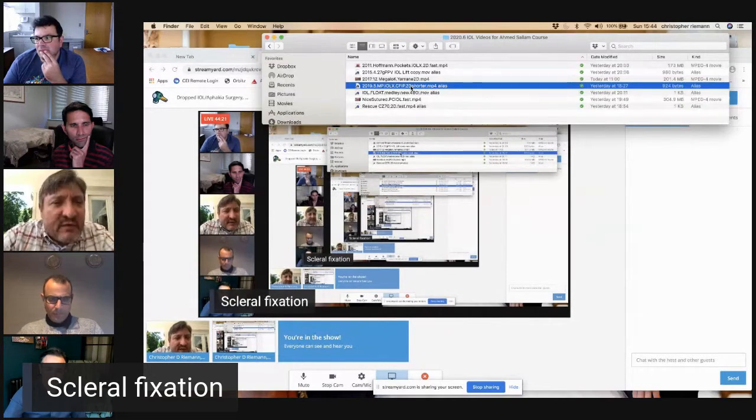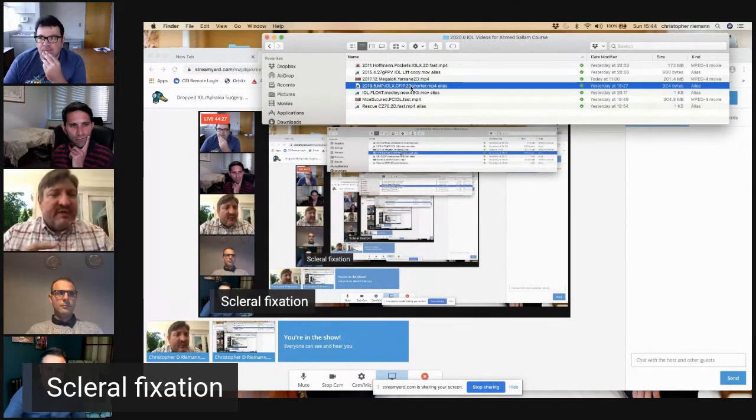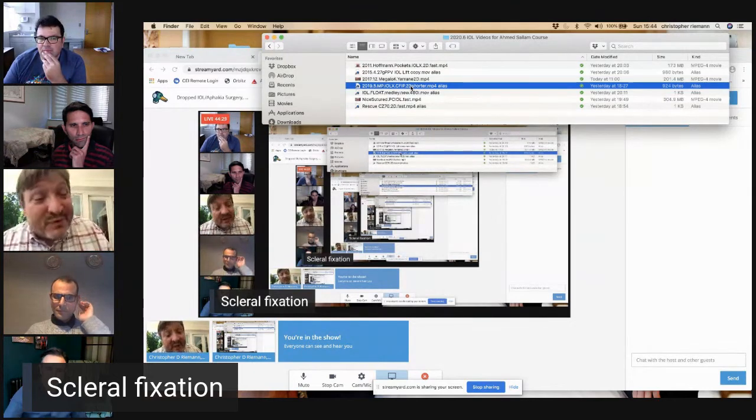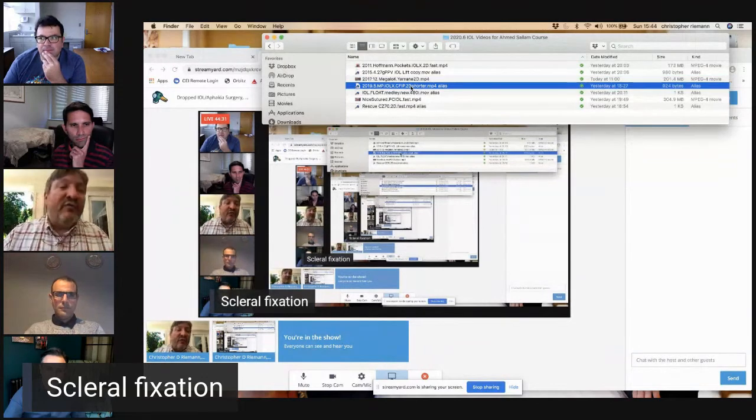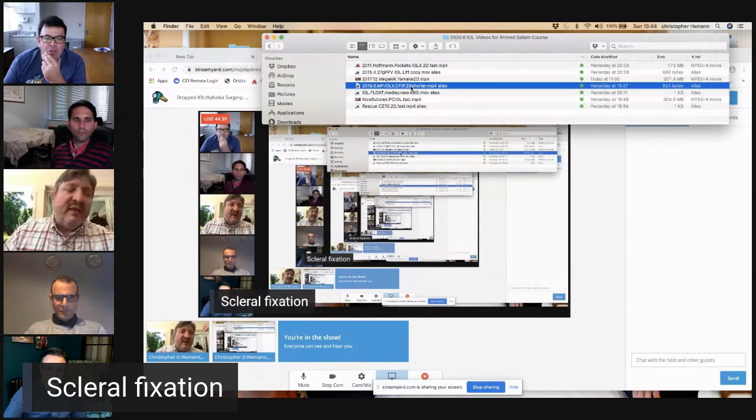In this particular case, honestly, I'm much faster if I open the conj and then close it, because of exactly what you're saying. But in this case, I really wanted to preserve the conjunctiva for some glaucoma procedure down the road, which we were able to do. But there's no reason why you can't open the conjunctiva and then close it.